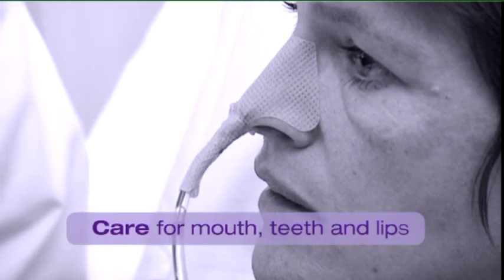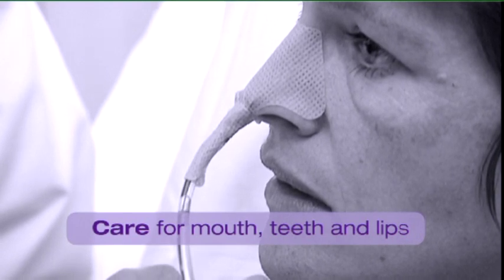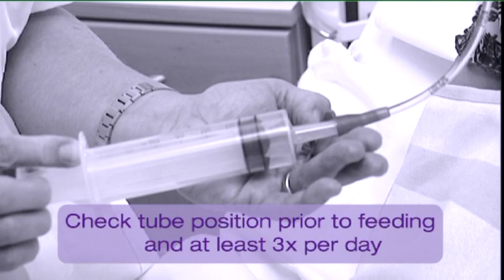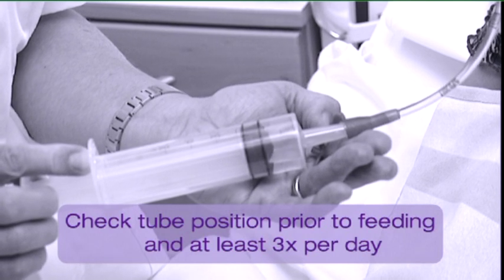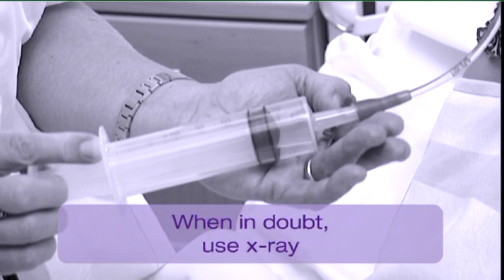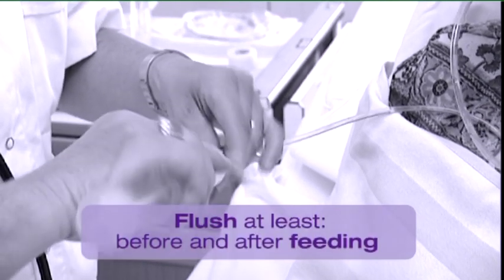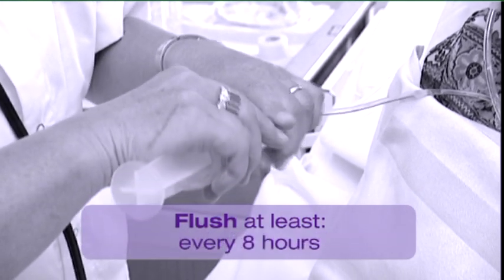Even if the patient is not able to eat, it is very important to take good care of the mouth, teeth, and lips. Check the position of the tube prior to feeding by measuring the pH value of gastric contents using pH paper — at least three times a day and with each change of nursing duty. When in doubt, use X-ray to check the position. Flush the tube with 20 to 40 milliliters of water before and after administration of feed or medication, and at least every eight hours.